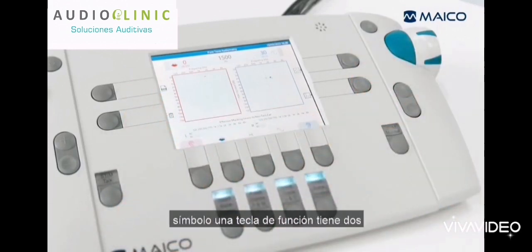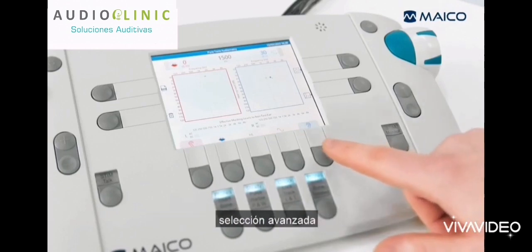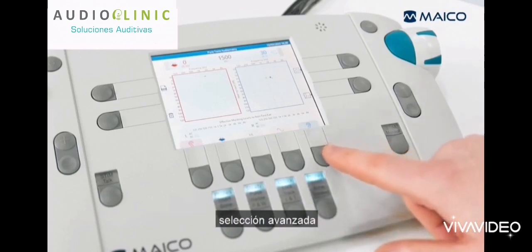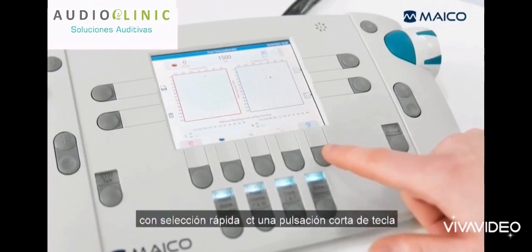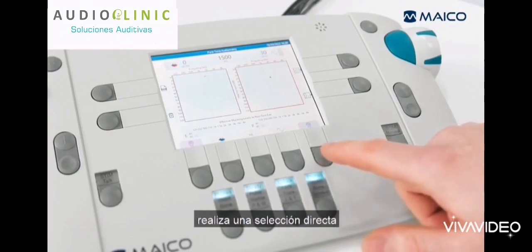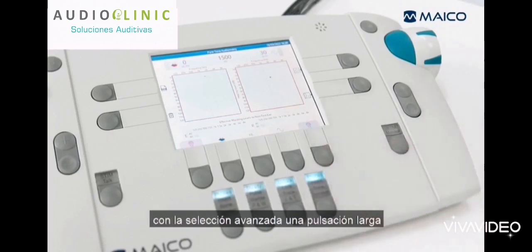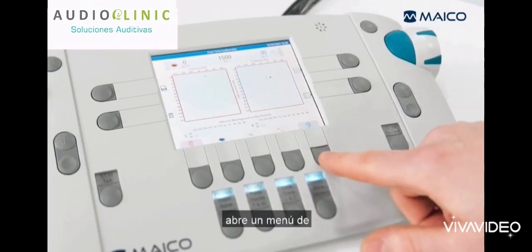If an arrow is displayed next to a symbol, a function key has two selection options: the quick select and the advanced select. With quick select, a short key press makes a direct selection. With the advanced select, a long press opens a selection menu.